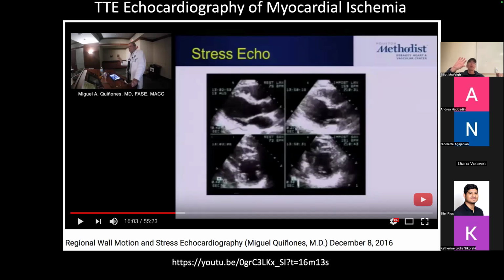You see the heart respond, and you see the chamber get smaller, right? And then you put it up to 30, and the chamber gets smaller. Put it up to 45, and it's like boom, boom, boom. The heart is really going for it. And then in those patients where this test is positive, one part of the heart asymmetrically stops contracting. And you just see it and you stop the drug. And you go, okay, we've got a positive test. We saw the muscle stop contracting.